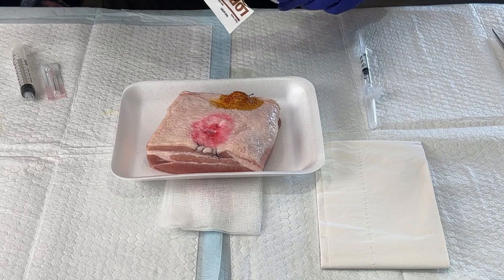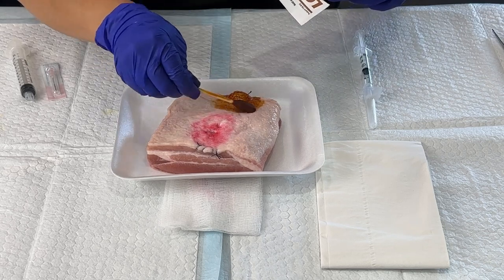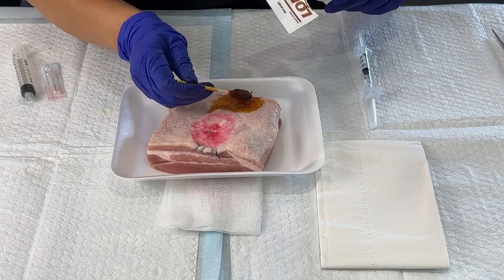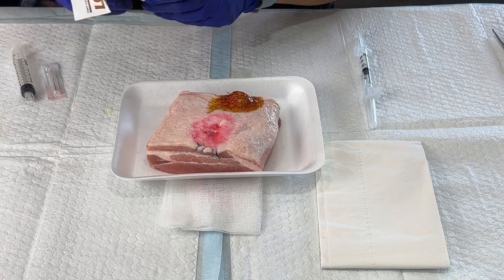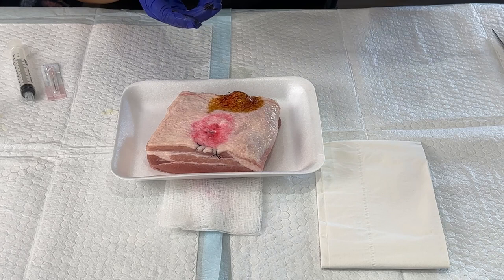I'm going to do that a couple more times, make sure the skin is nice and clean. And one more time. Then I'm going to draw up my numbing materials.